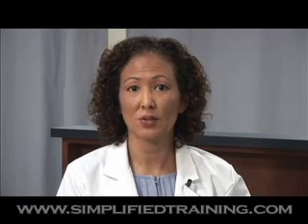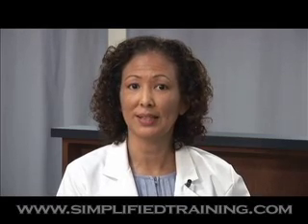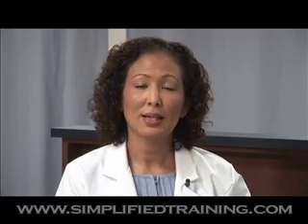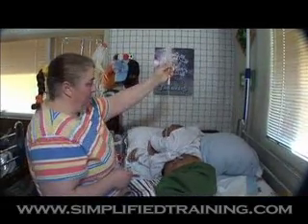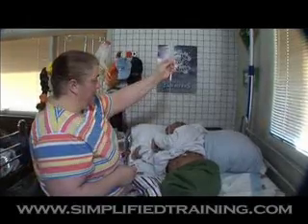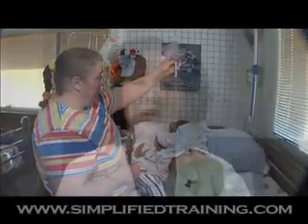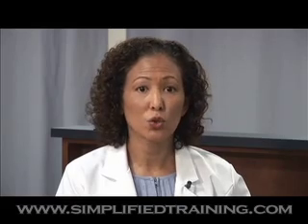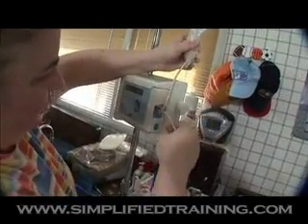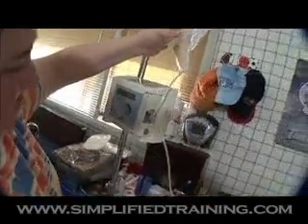Begin the feeding by decompressing or burping the tube. This allows the normal buildup of stomach gases to be released before starting the feeding. To begin, attach an empty 60 cc syringe without the plunger to the end of the tube. Hold upright and be careful not to tug on the tube. The open syringe attached to the tube will now allow air trapped in the stomach to escape, sounding like a natural burp. This is good. This makes room for the feeding and relieves any feeling of pressure in the stomach.